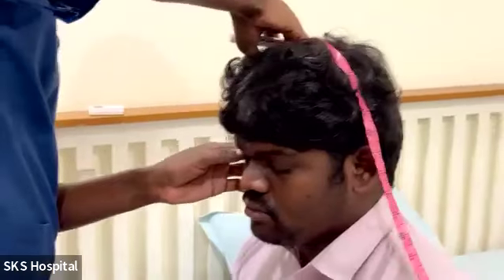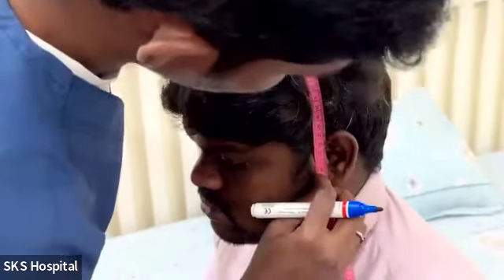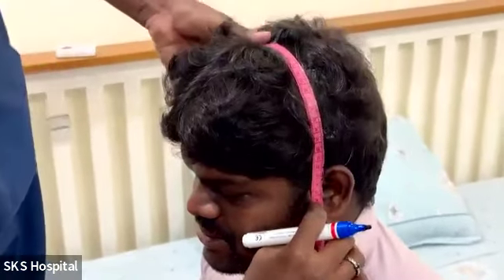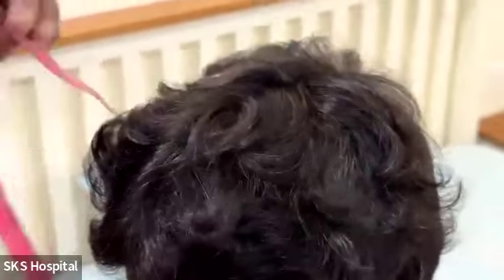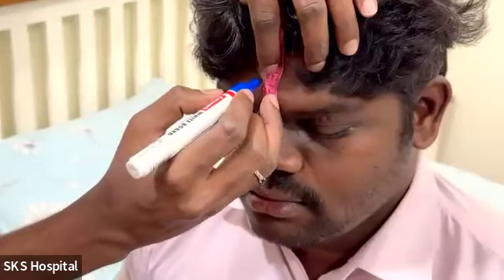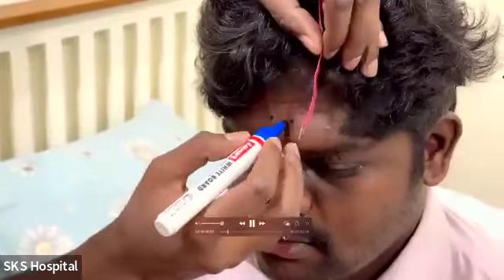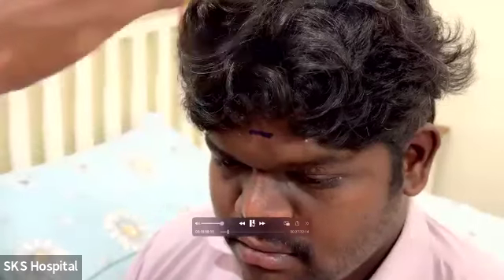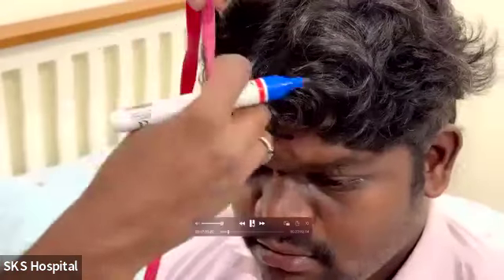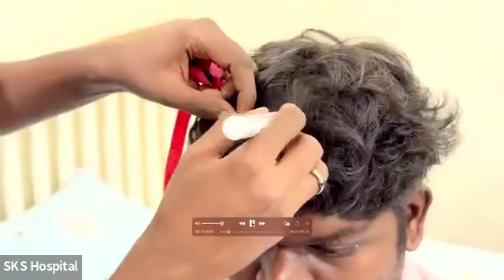Now coming to the second step, where you mark the preauricular distance, both right and left. Whatever is intersecting with the anterior to posterior line becomes the CZ. We have already found out how much the 10% is. So this is the nasion, and this is the next point, which is 10%, which becomes FPZ. So it is in the midline. From there we start to mark with 20%.